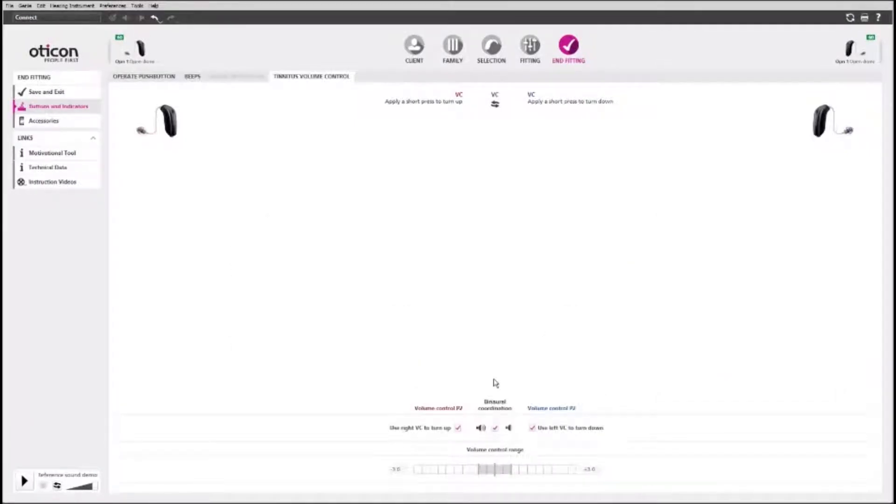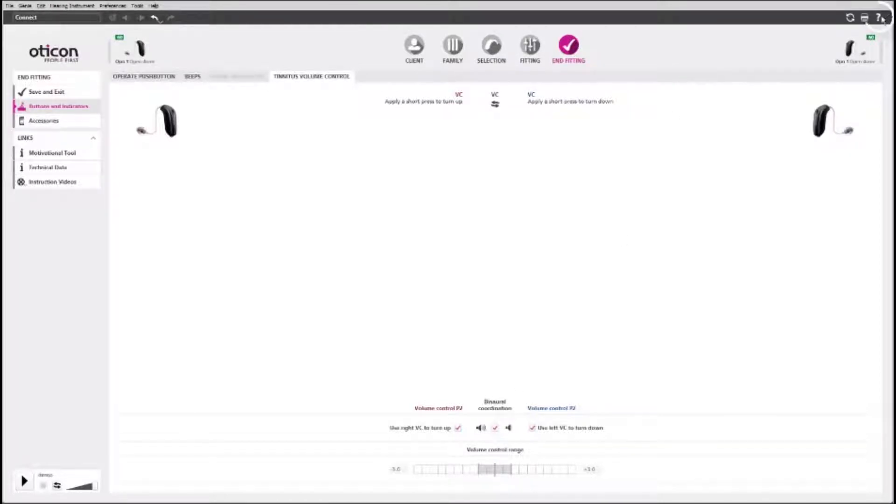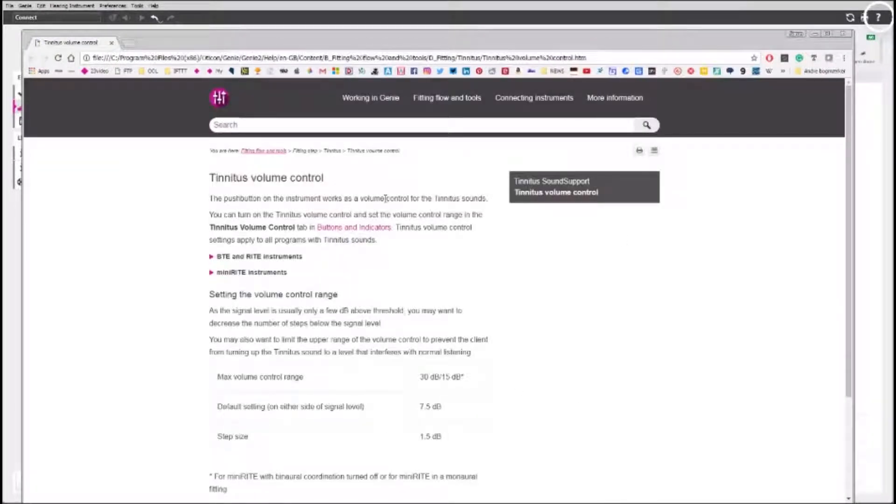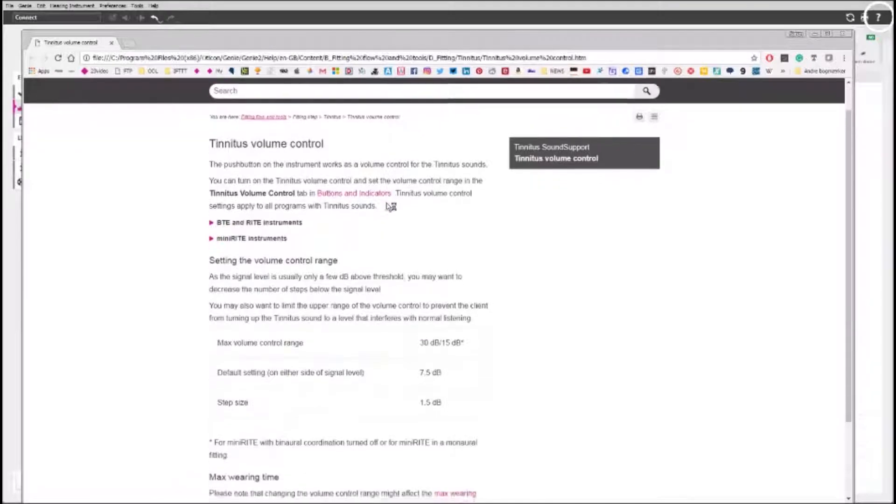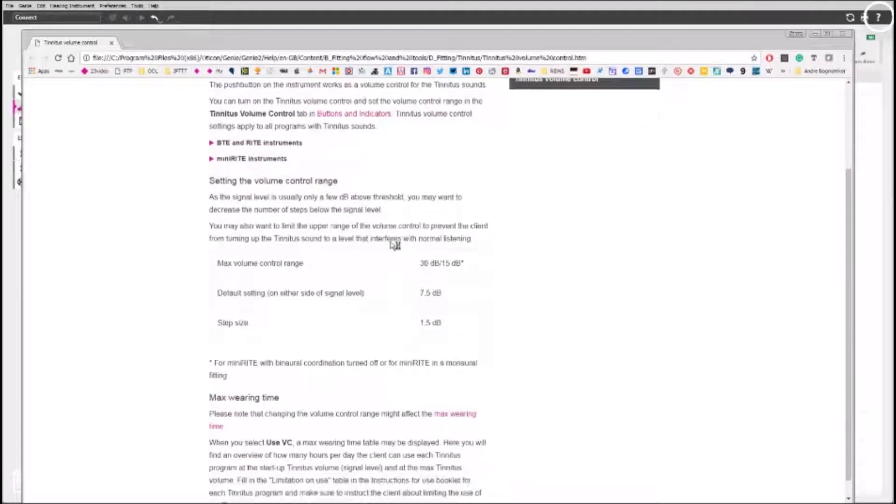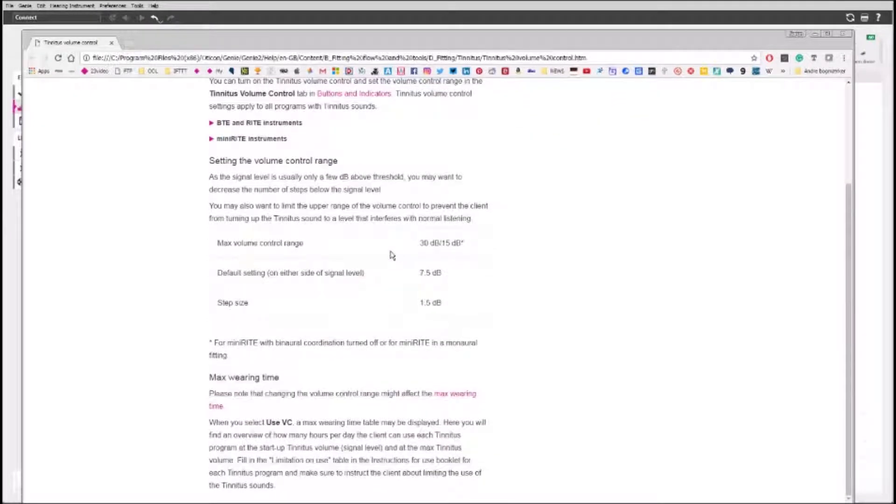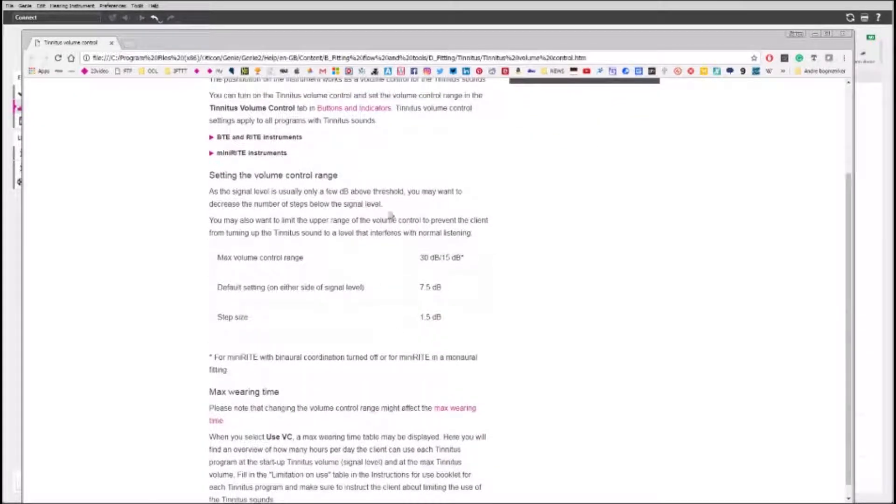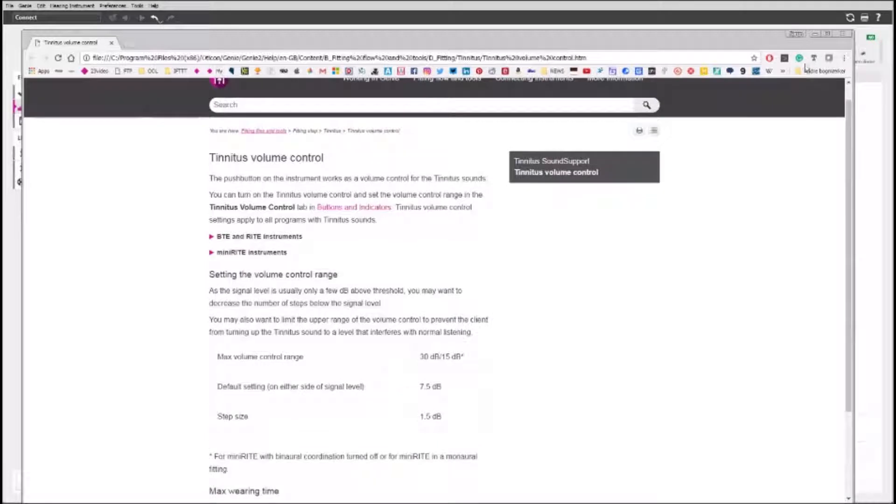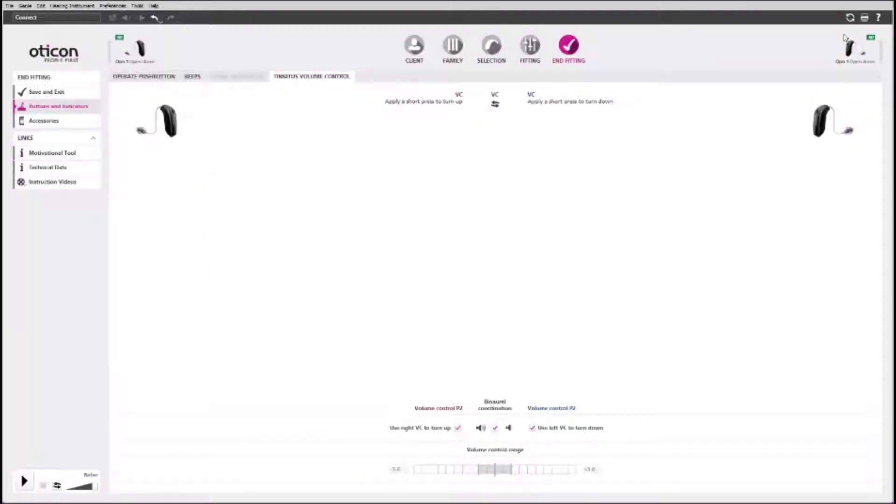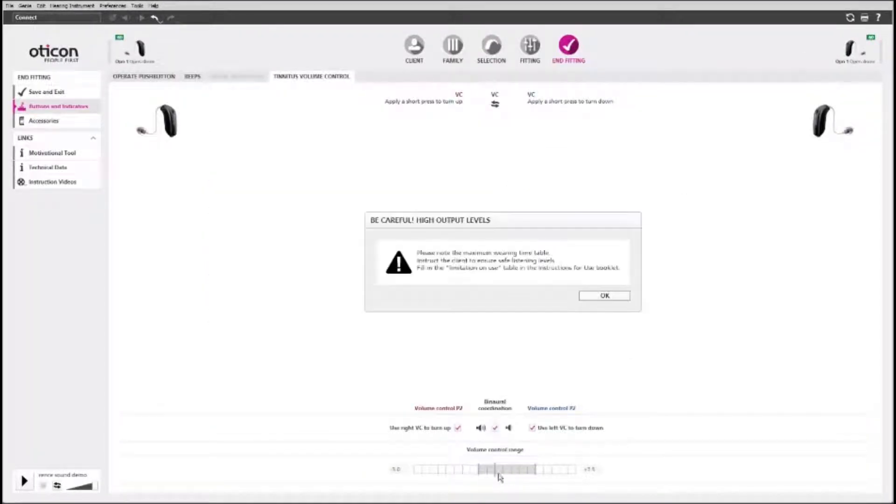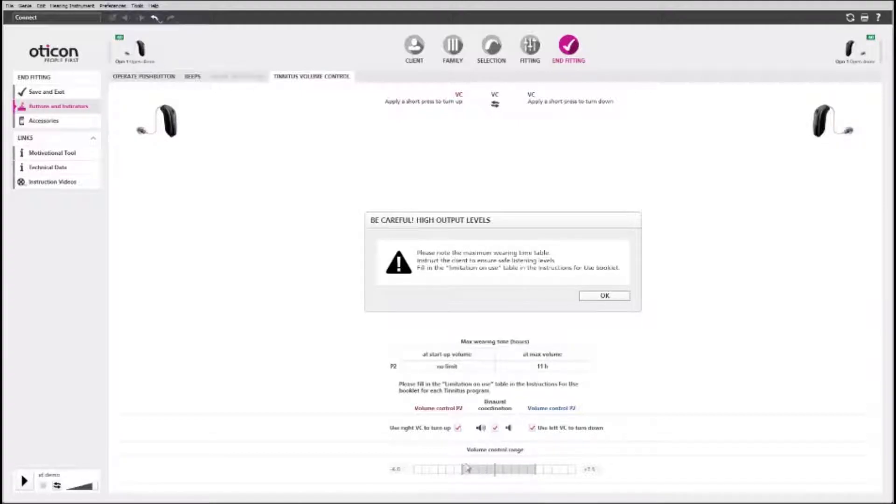You may want to adjust the volume control range. Please refer to the help file to see the range for different hearing aids. Please be aware that the tinnitus relief sound can exceed 80 dBA SPL. If you receive a warning, you should counsel the client about maximum wearing time.